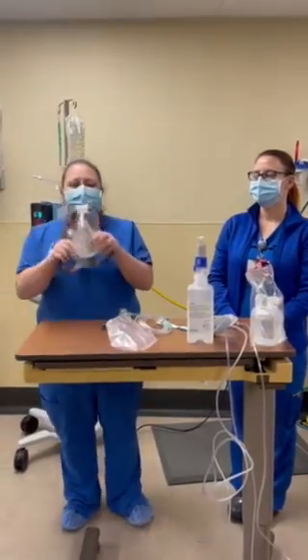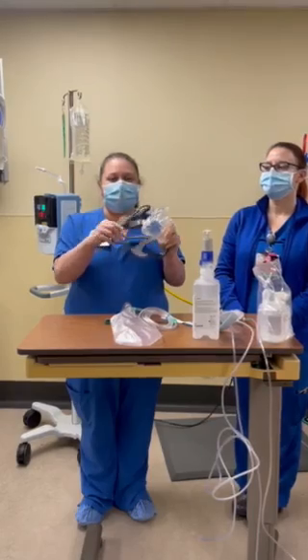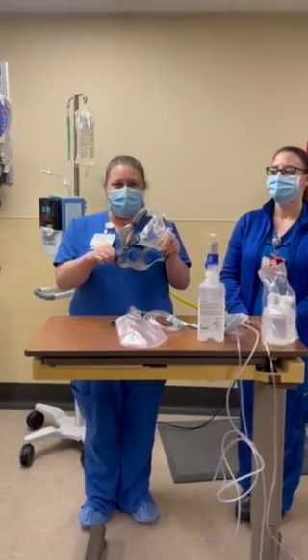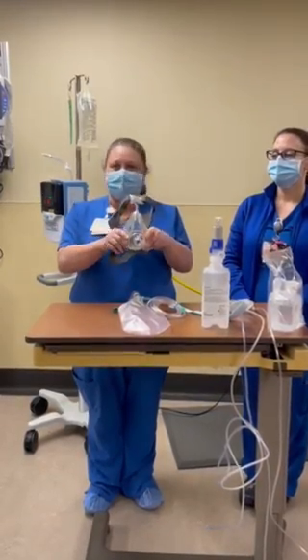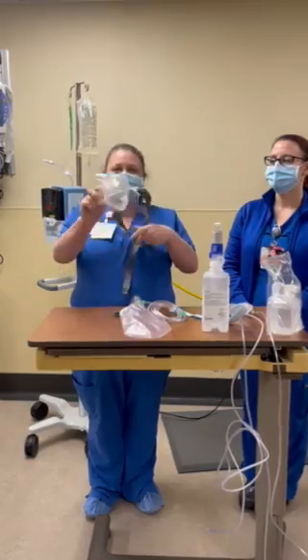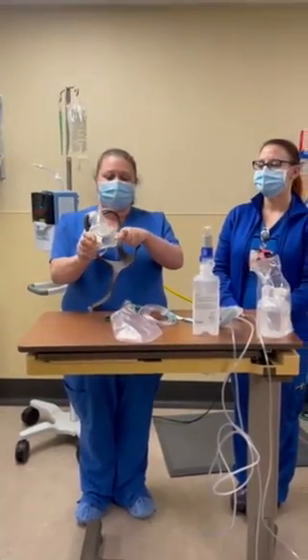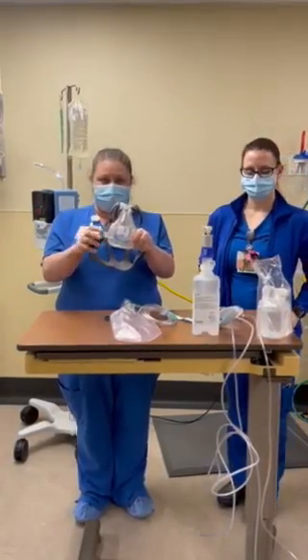Next, we're going to talk about BiPAP masks. They have clamps on the sides of them. Please do not adjust the Velcro. When we initially put it on a patient, we set it to that patient perfectly. All you need to do is snap off the pieces to pull it off their face. And also to put it back on, you put it on them and you just snap the pieces.